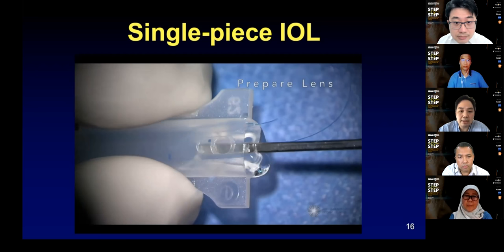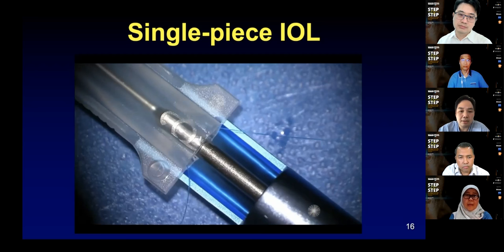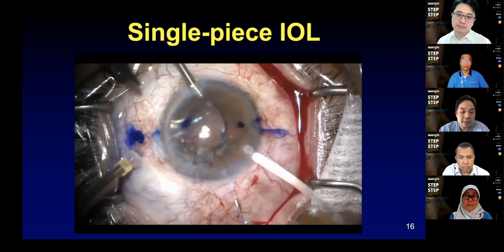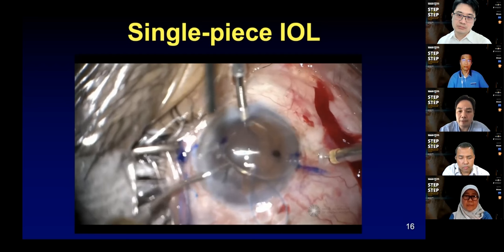So you put the sutures in, and this is the Monarch injector from Alcon, and injects the lens in. So this is through a smaller wound, obviously. So you don't have to open up the wound to use the folding forceps. Same principles apply again. So you have the sutures in, you exteriorize with the 27 gauge needle.